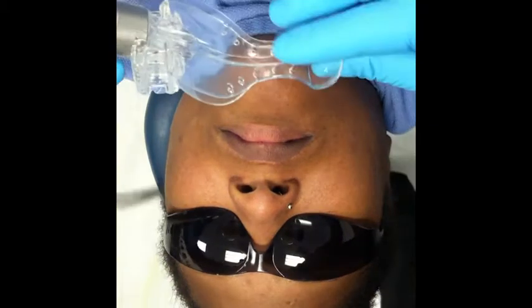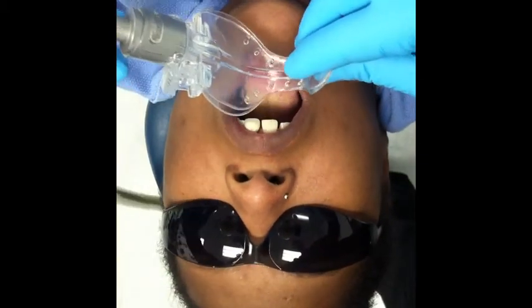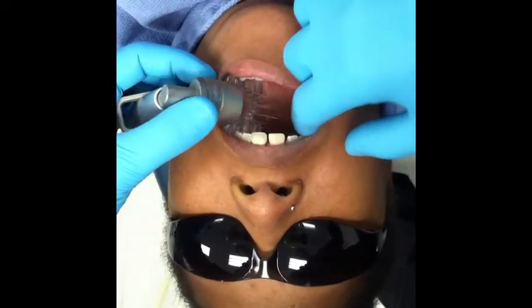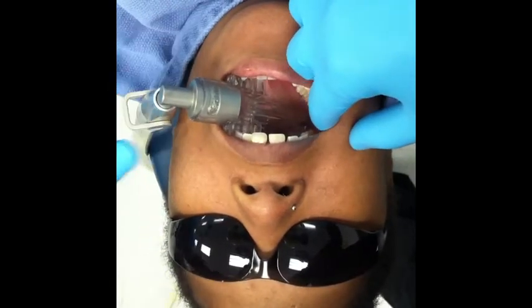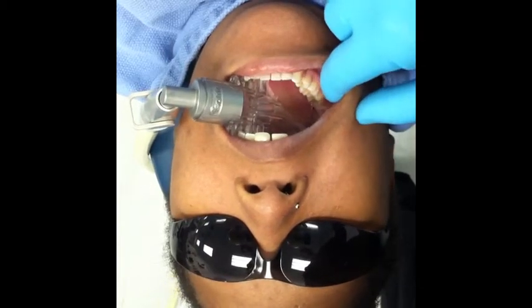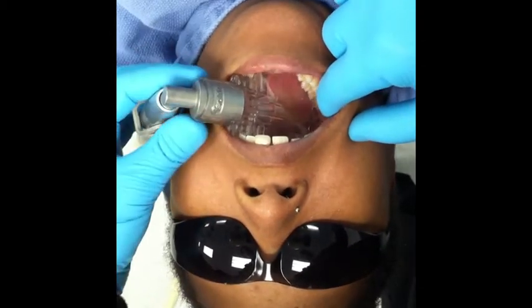This is the adapter on the valve. Open wide for me. Bite down a little. About halfway. Take that out.